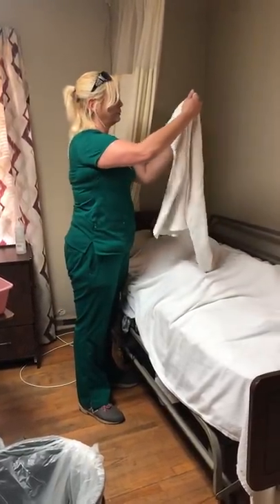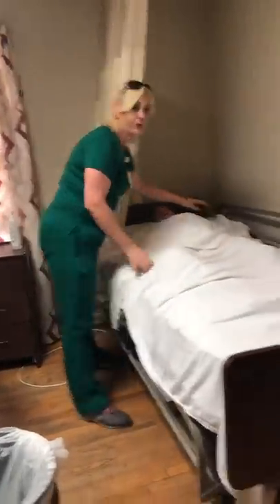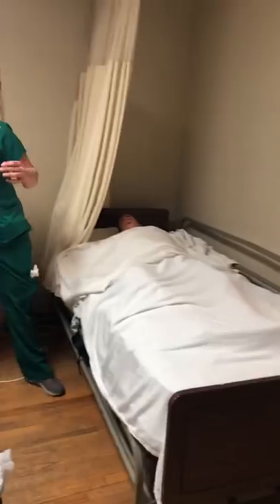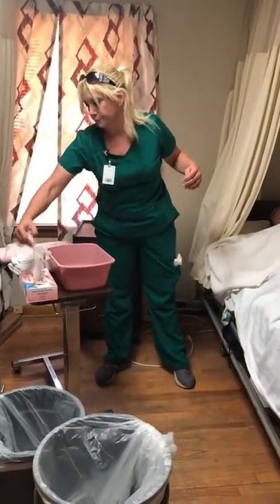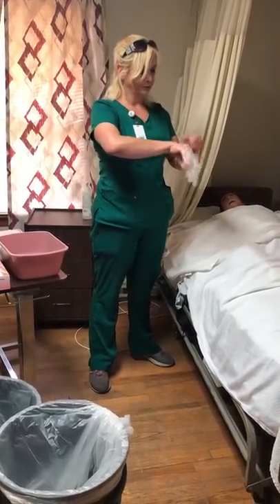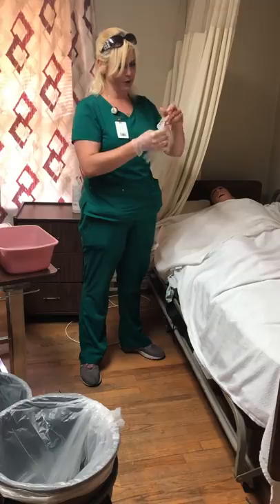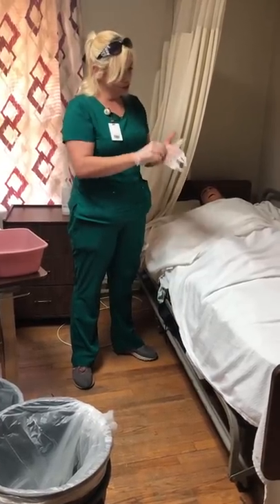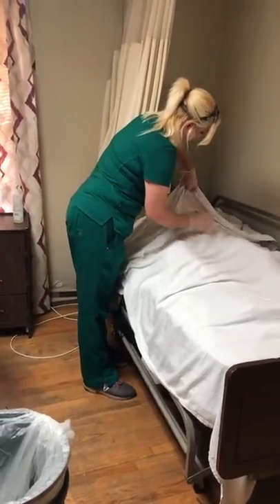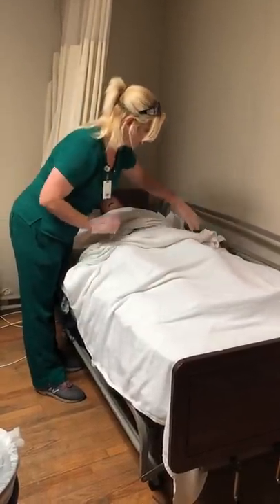I'm going to take my bath blanket. I usually only unfold it to about half and put that on the top half of my resident. Now I'll put my gloves on before I go any further. I'm going to take the sheet and blanket and fold it down to about their waist.